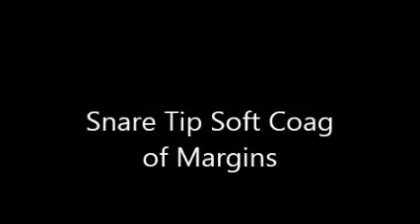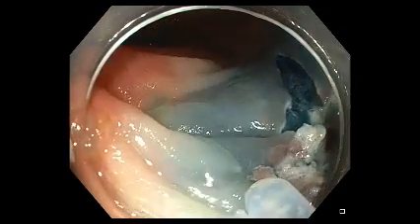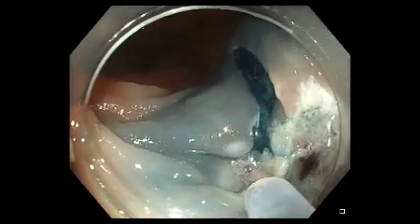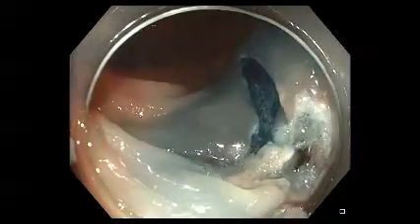In some cases, if there's uncertainty as to whether there's a complete resection, we can cauterize the margin using either argon plasma coagulation or more efficiently the simple tip of the snare. We expose one to two millimeters of the snare tip and then apply a low voltage or soft coagulation current to the margins.